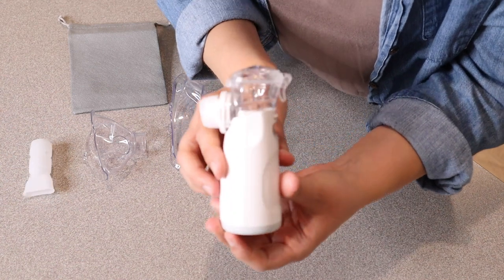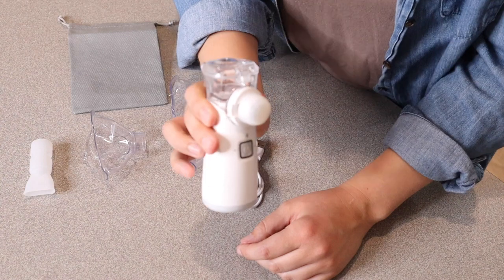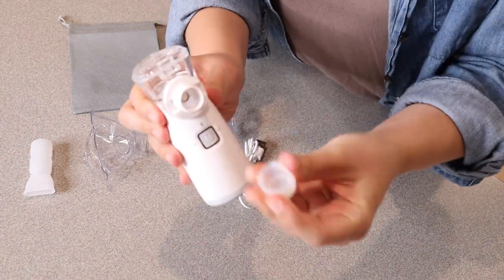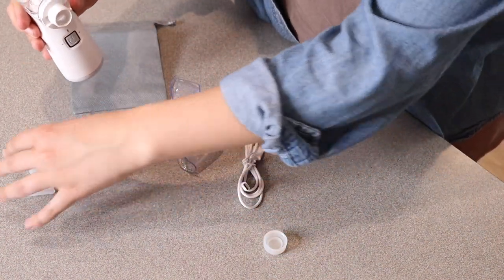First of all we have the actual nebulizer itself. I really like how ergonomic this is — it's small and nicely handheld. Right here in the front we just have a little power button, and when you take this little cap off you're ready to put on whatever device you are wanting to put on here.